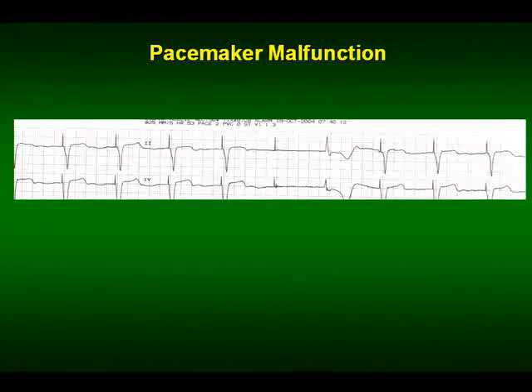Okay, so what is this? Let's see how we analyze things. Well, it's just like any other arrhythmia. Let's first identify the QRS complex, and we can see that there are 4 wide QRSs that are associated with a pacing spike. There is a narrow QRS that is not associated with a pacing spike, and then there's a pacing spike which isn't associated with a QRS.